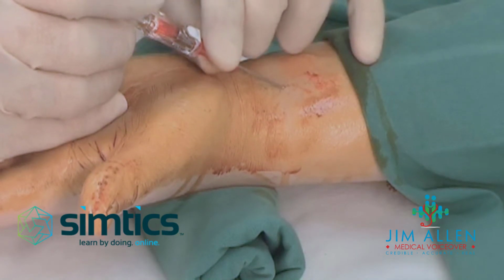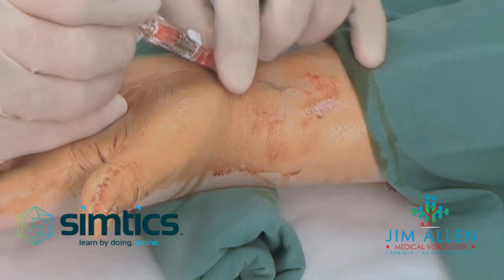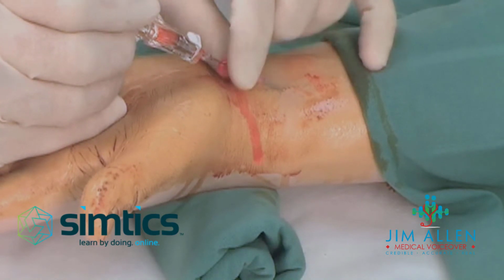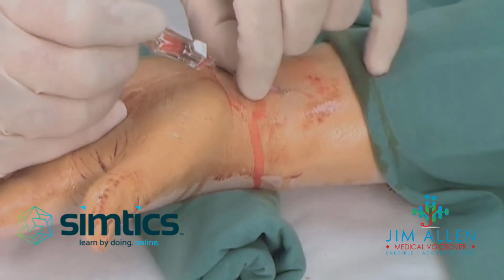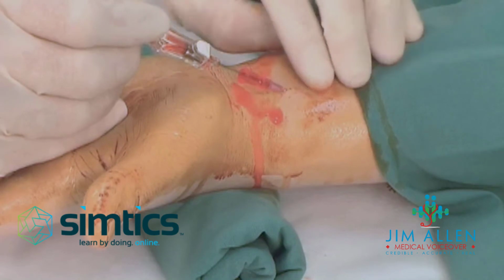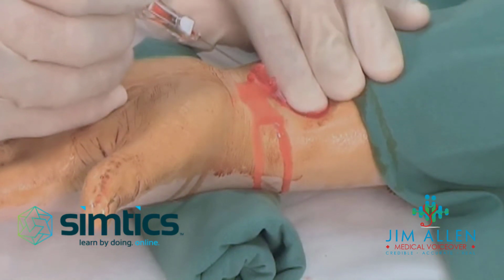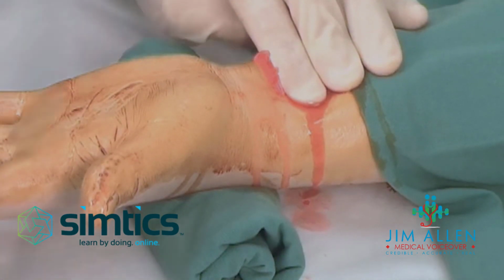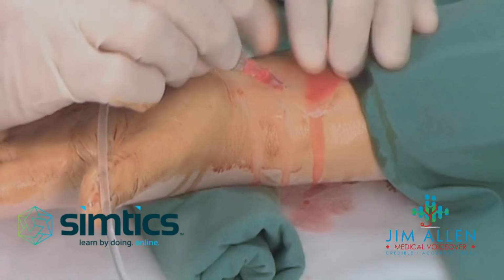For the catheter over needle technique, insert the needle a further 2 millimeters and, with a twisting motion, advance the catheter over the needle into the artery. Apply pressure over the proximal artery with the fingers of your non-dominant hand while removing the needle. There should be a flashback of blood into the catheter. Attach the pressurized line to the catheter hub.